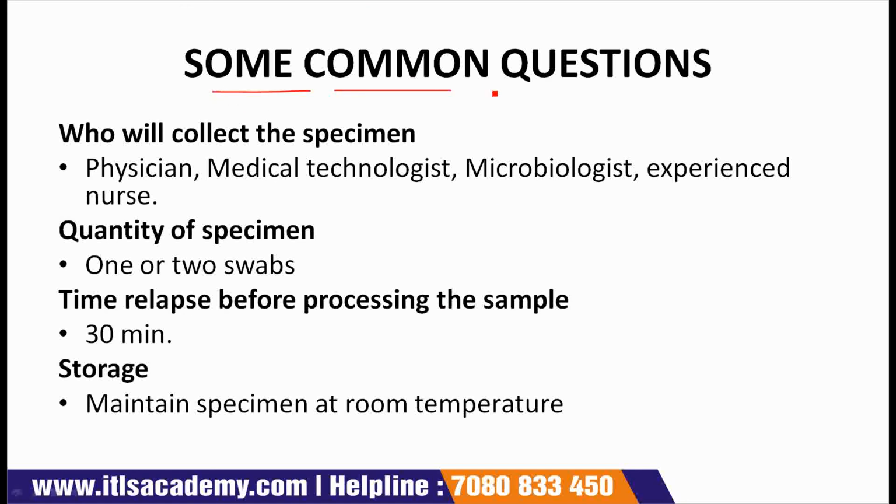Some common questions regarding collection of specimens are given. First one is: who will collect the specimen? The answer is physician, medical technologist, microbiologist, and experienced nurses will collect the specimen from the patient.